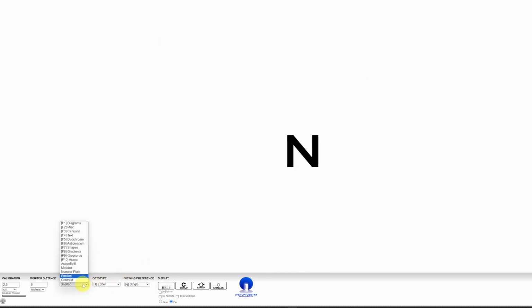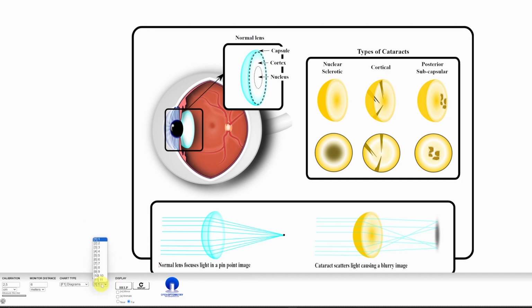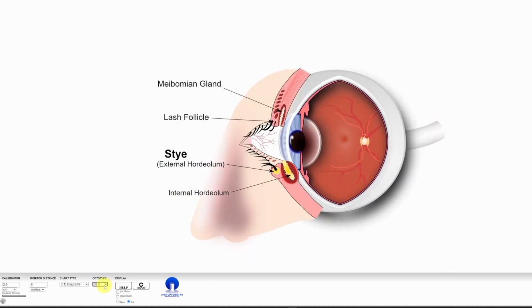So that's Snellen. There's a whole lot of other things in here. There's diagrams, for example, for explaining things. I guess you could customize these images to anything you wanted, but it has those.